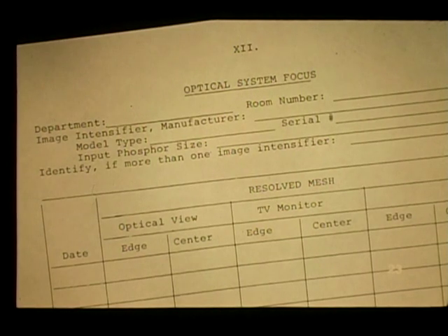Number 23. It's easier for program participants to record test data if they can write the information on standardized forms. Test forms should be simple and should allow easy comparison with previously gathered data. The form should record basic information such as the room number, the test performed, and the date of the test. The technical factors such as KVP, MA, time, and distance should be recorded as well. Finally, the form should contain the test results and any comments pertinent to those results.